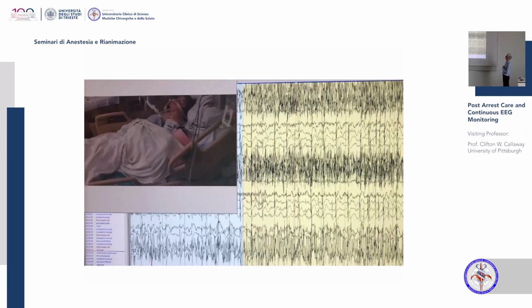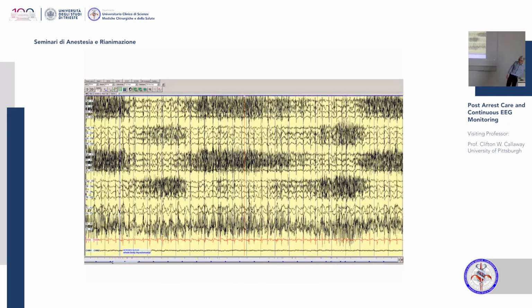Her EEG now has epileptiform discharges. And you can see the spikes on those tracings where there's not EMG artifact that look like EKG marching through. This is a movie. I can't show it to you here on this computer, but for those of you in the room, you can play it. We'll try it some later time to see if that's a movie that you can see. But you've seen the jerks, and they continue with those epileptiform discharges.